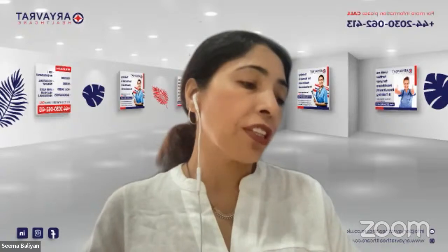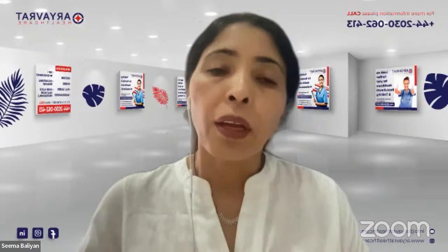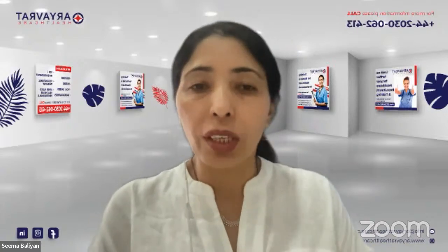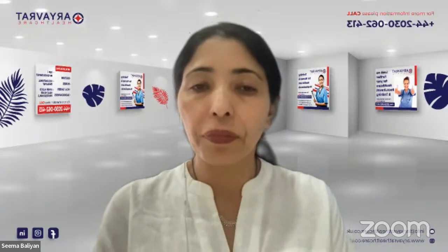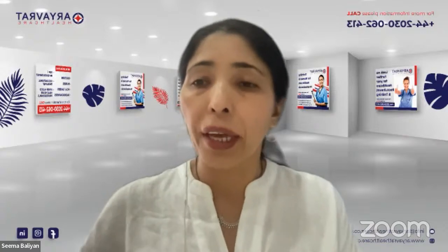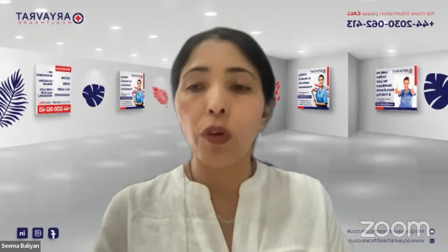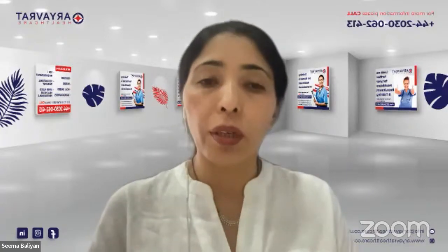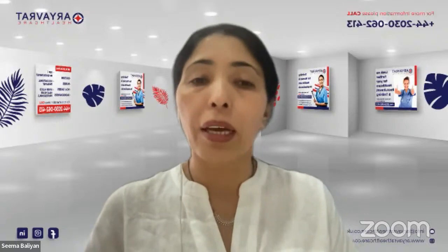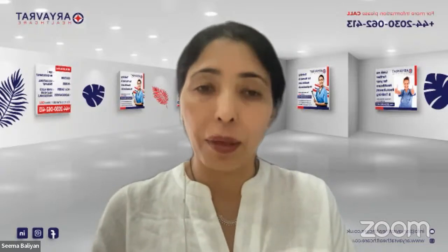So if we take our first instrument, which is your peak flow, the scenario is going to be something like this. The patient has recently been diagnosed with asthma and has been started on inhalers, but has also been advised to use a peak flow and measure his peak flow before and after using the inhalers, and then see a GP in about a month's time.